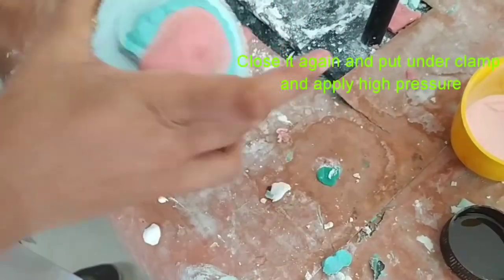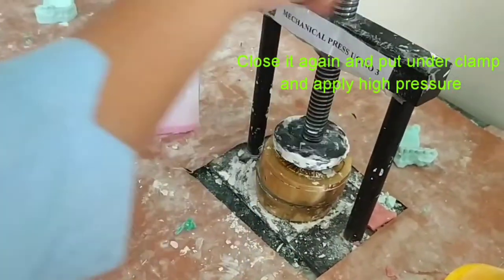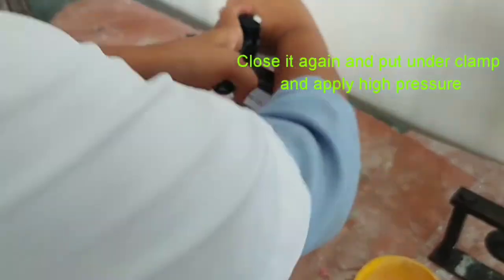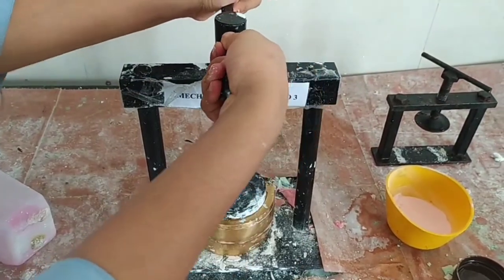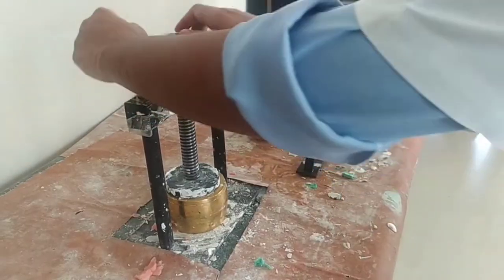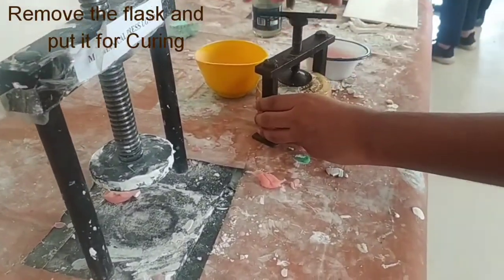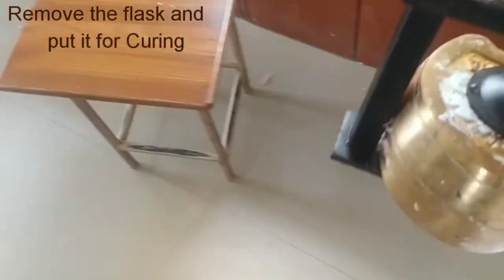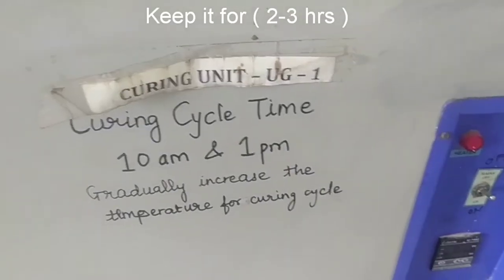Put all the parts together again and place them under the clamp with high pressure. Keep it for almost half an hour. After this, remove the flask, put it in the smaller one, and then place it in the curing unit for three hours.